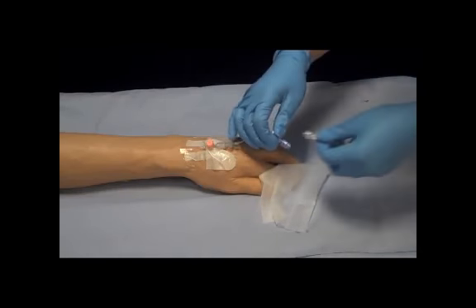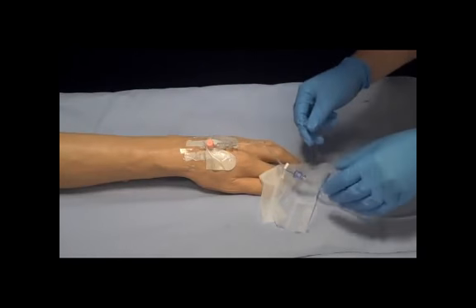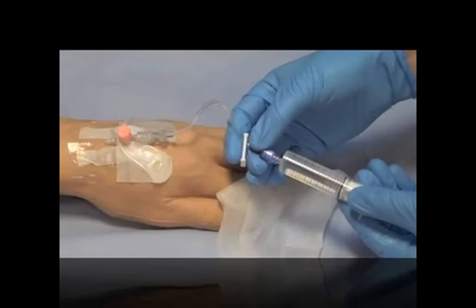If you're going to give your antibiotic via an IV infusion, then once you've flushed it for the first time, connect up your IV giving set and then set the drip rate on it. Finally, once your antibiotic is delivered, then take your flush and finish flushing your cannula through.